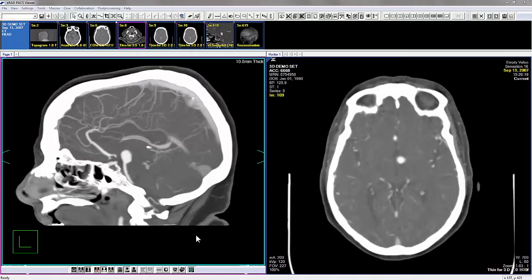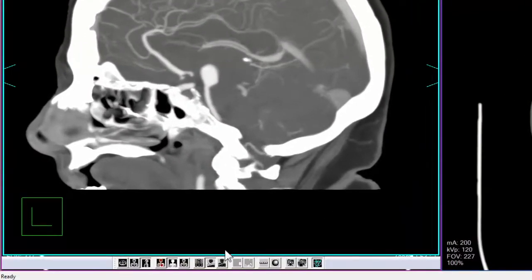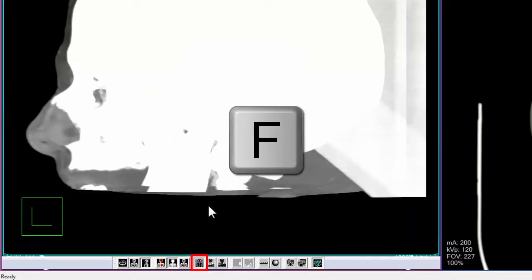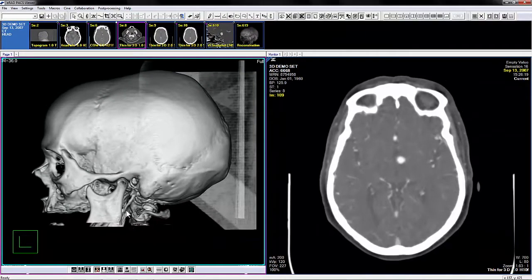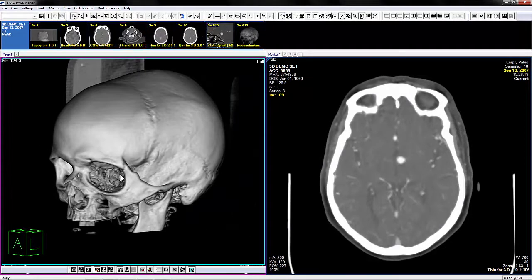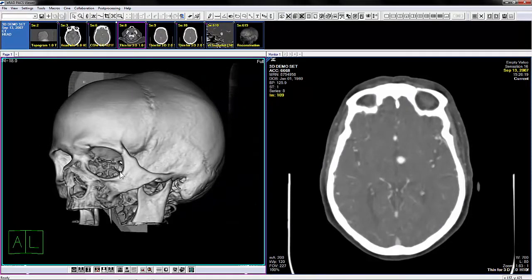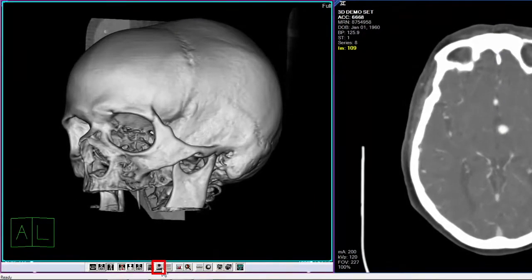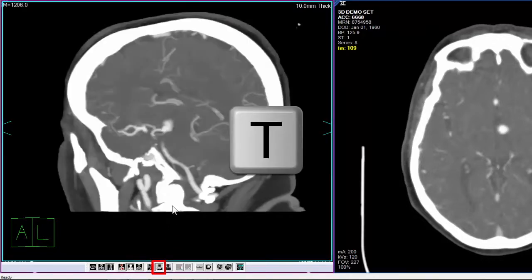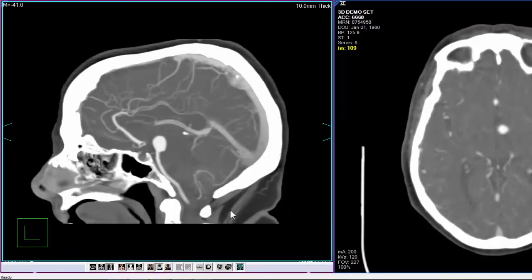Reconstruction modes can also be controlled via the toolbar and keyboard shortcuts. This is the full reconstruction icon; its keyboard shortcut is the letter F. Full reconstruction mode renders the data as a three-dimensional volume. This mode is commonly applied with the DVR projection mode.